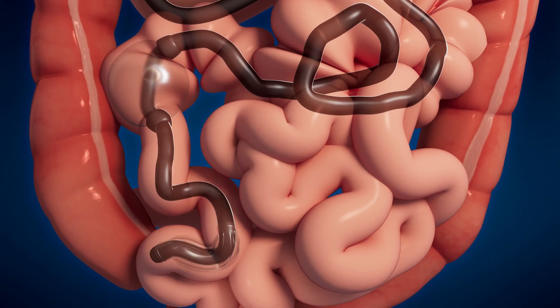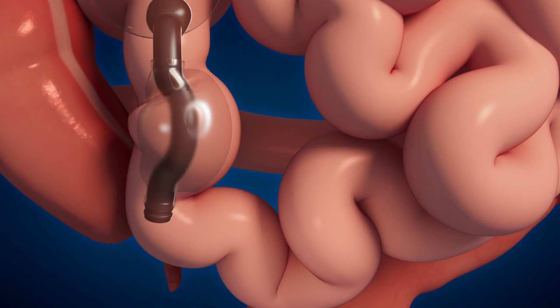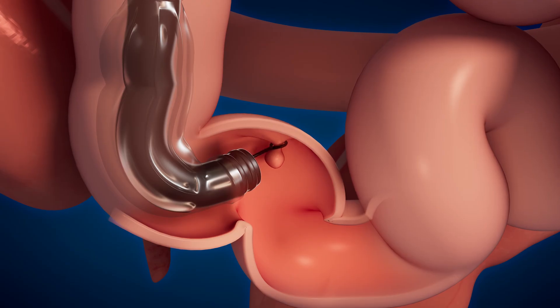In this example, the double balloon scope is advanced deep into the small intestine to treat a polyp that was visualized previously on a capsule endoscopy procedure. The scope is advanced to the site of the polyp and a small snare is advanced through the instrument channel.